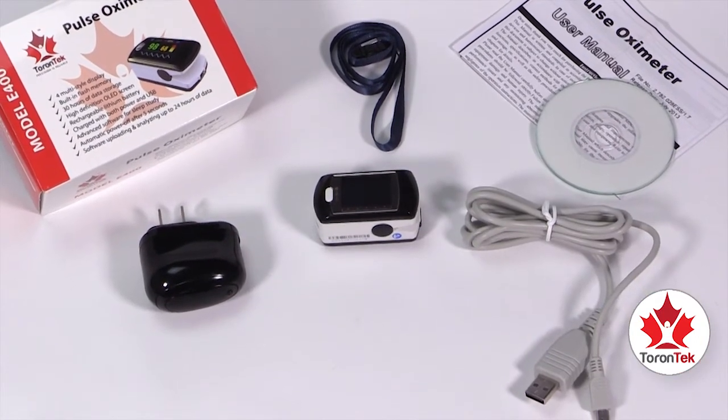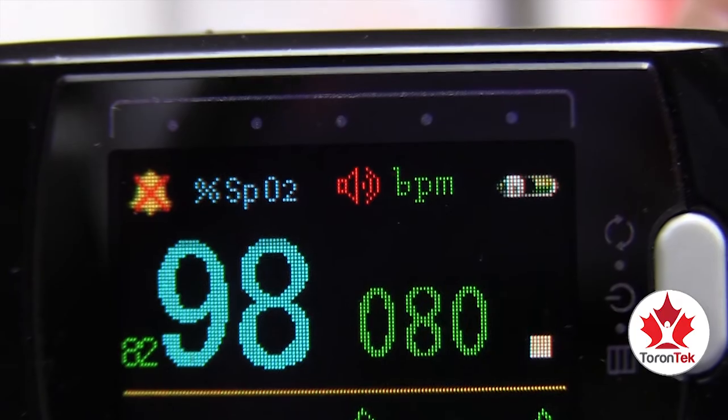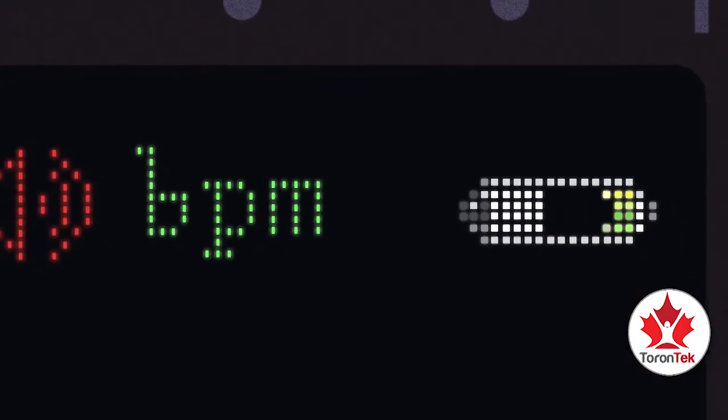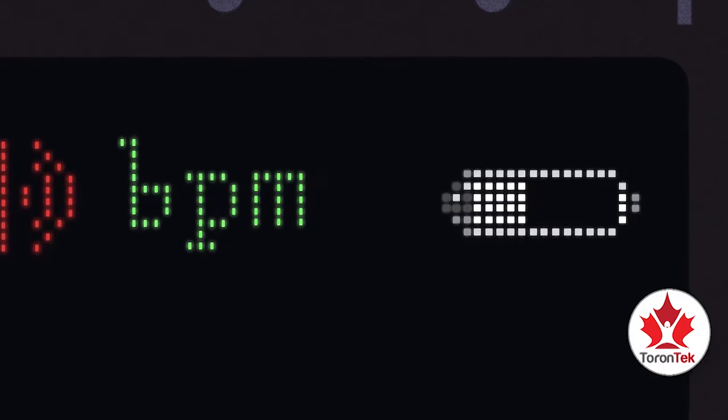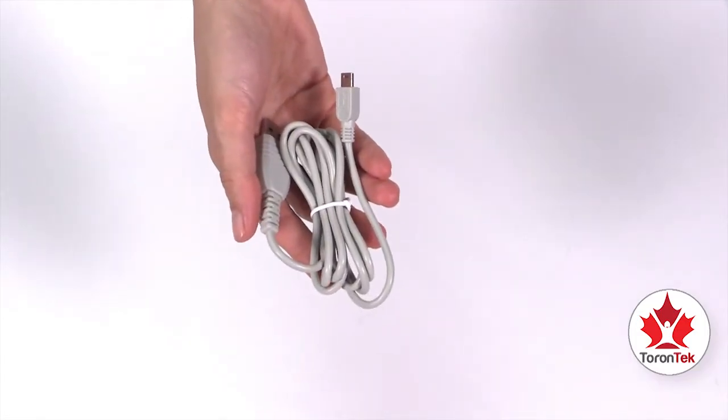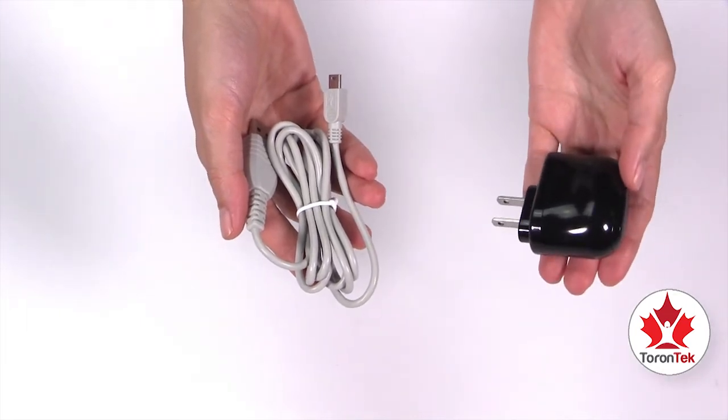You can check the battery status by looking at the indicator on the top right corner of the screen. An empty battery icon indicates the battery needs to be charged. To charge the battery through a power outlet, use the USB cord and wall charger that come with the device.